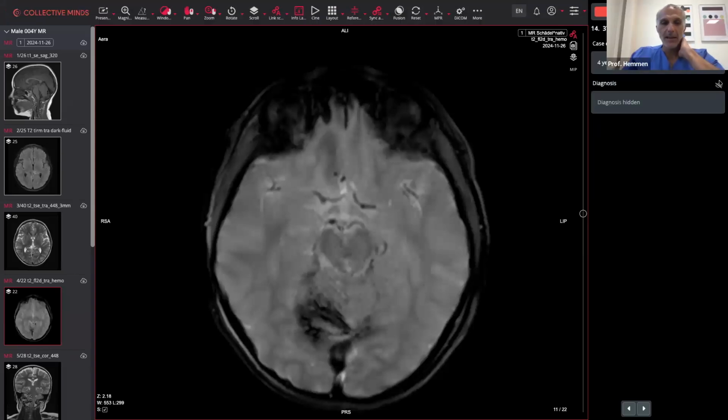Thanks, Eddie. But again, I would think the hyperfine or the low field would add on, especially if you wanted to do serial imaging. And as long as the child doesn't need any sedation and it's easy to perform at the bedside or in the room where he was sleeping with his mother, it's not a big hassle. Okay, thank you very much.